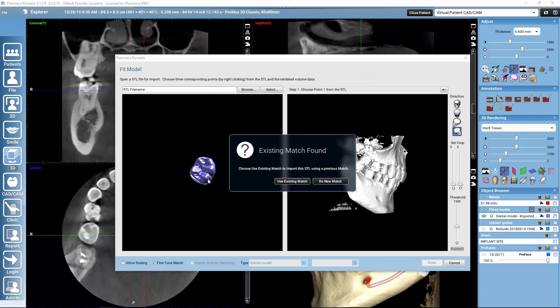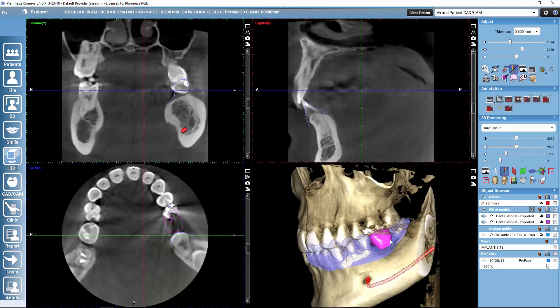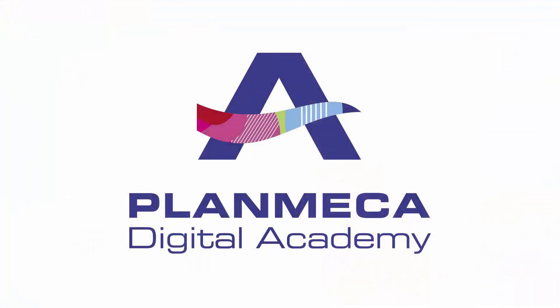Romexis notices that this crown design has been designed on top of the intraoral scan that we already imported. That means Romexis knows where this crown belongs, so instead of needing to give any points I can just select use existing match and the crown is dropped automatically to the right place. This way you can also bring in the upper jaw scan if wanted. This works for any STL files — whether they are intraoral scans or whether you have used a traditional impression and digitized it — you can import both in the same way.